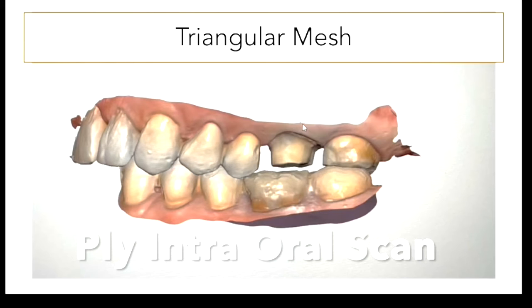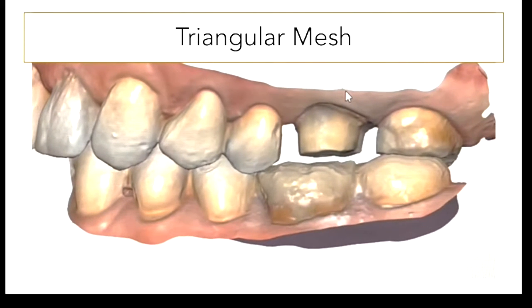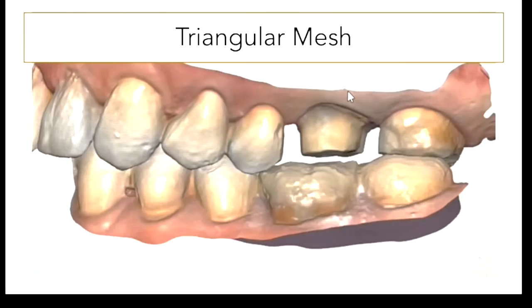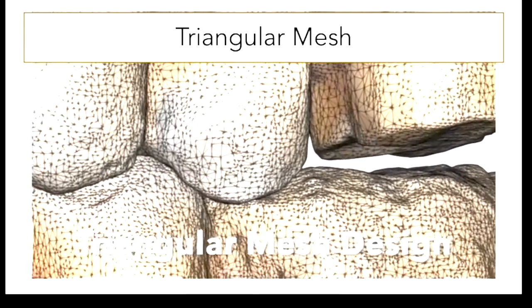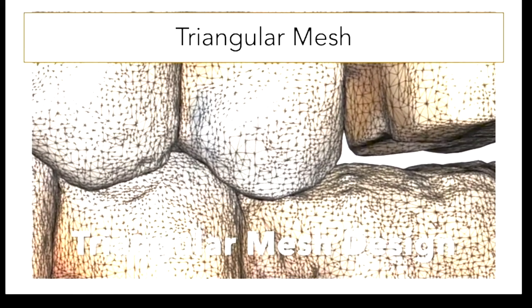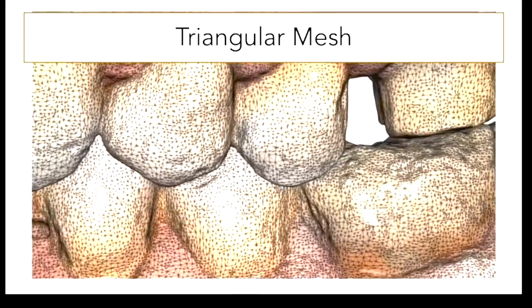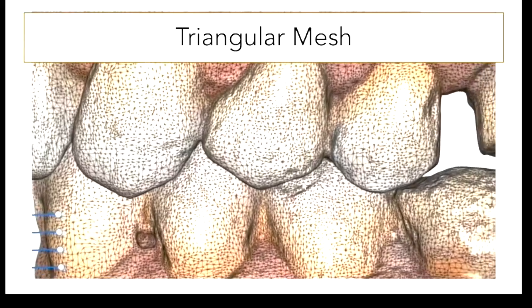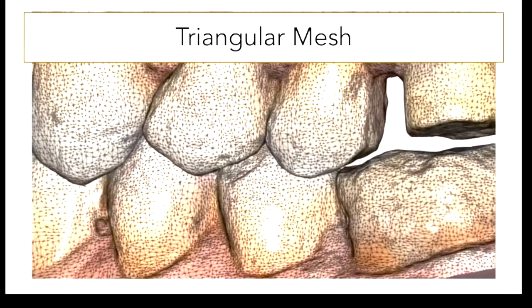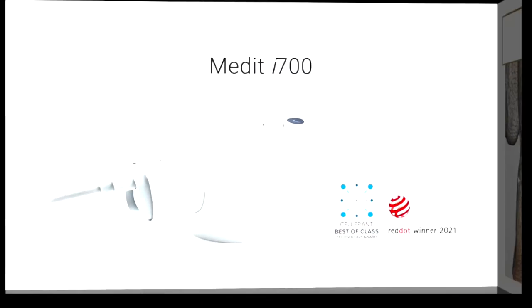What you're envisioning is a triangular mesh. The PLY file is color; STL files are black and white or a single color. If you come in close, you can see the small triangles making up the mesh design — these are what make the curves and shapes of the teeth. You can take these triangles and erase them, modify them, change them. This is what the world is now doing instead of alginate impressions.